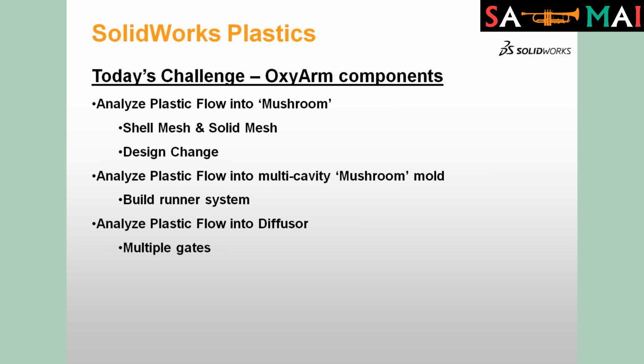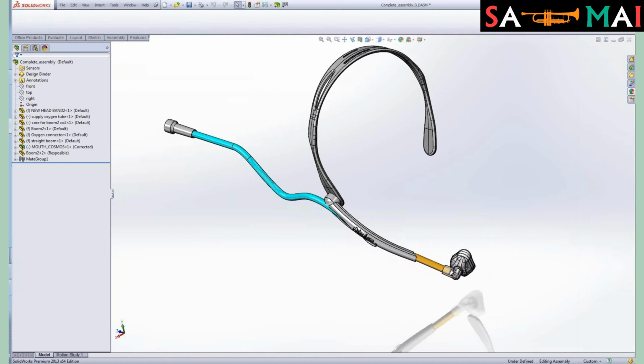The second thing that we'll do would be analyzing the flow of a multi-cavity mold. This would be functionality that we would find in SolidWorks Plastics Premium. And then the last is I will show a third model, the diffuser, where we analyze multiple gates. So let's take a look at our oxyarm here.